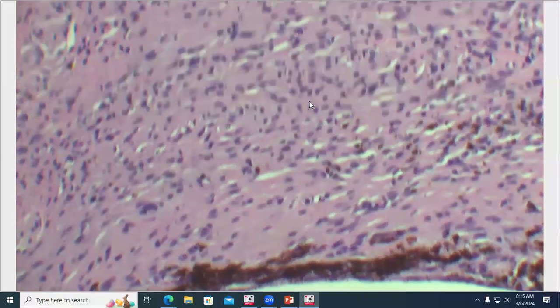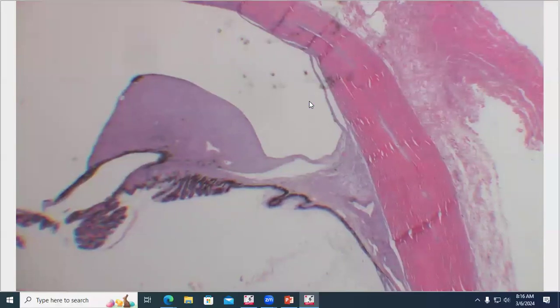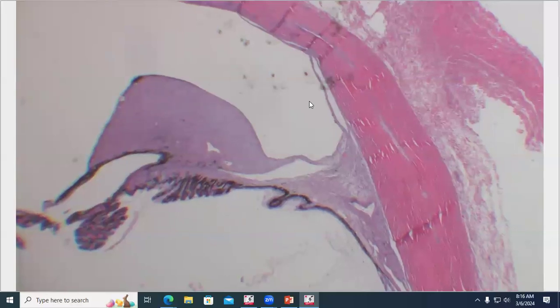So as I pointed out on the gross photo, this is a blue eye, and we have a nondescript-ish spindle cell neoplasm within the iris stroma. So this is consistent with a uveal schwannoma of the blue-eyed dog. They are notorious for causing weird distortion of the iris, including ectropion uveae, where, for some reason, they very commonly will end up pulling that iris epithelium around to the front of the iris. In fact, some cases come to us with a history of iris color change from blue to brown. And that's the reason why, because that iris epithelium is being pulled around to the front of the iris. And in this case, it also greatly distorts the iridocorneal angle. So that gives us a really nice reason for the glaucoma that they diagnosed.